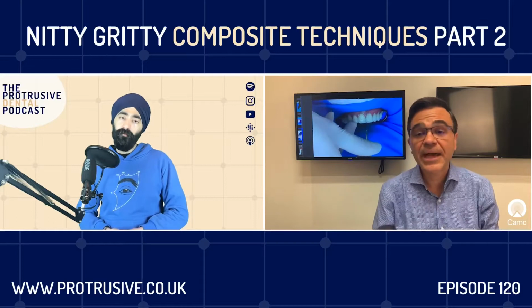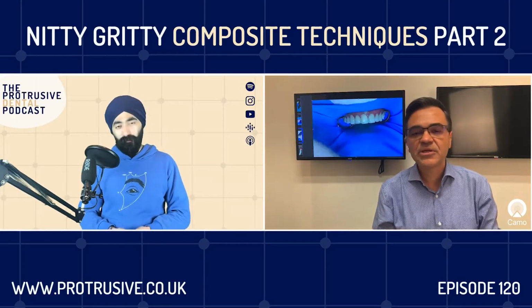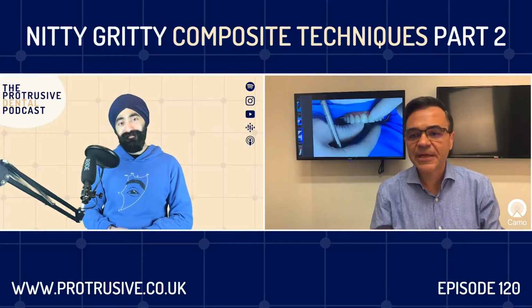And then you take off any excess with your IPC instrument, and then you put back your Mylar strip. And then you can light cure it. And you're gonna get a very strong and durable contact in anterior teeth, okay? And that's called the Mylar pull technique. And I use it every day, and it gives me great results.